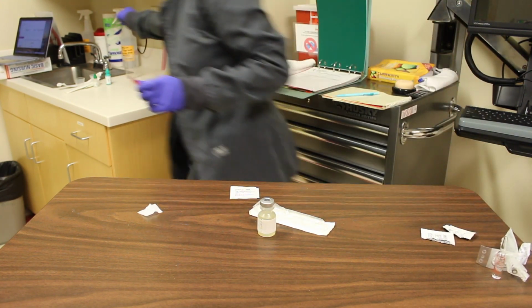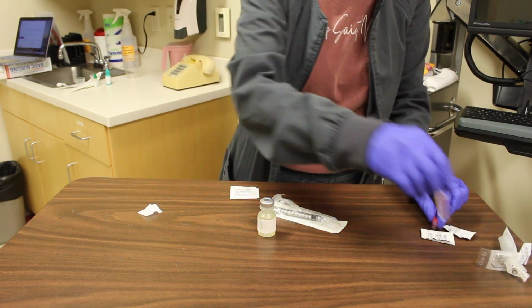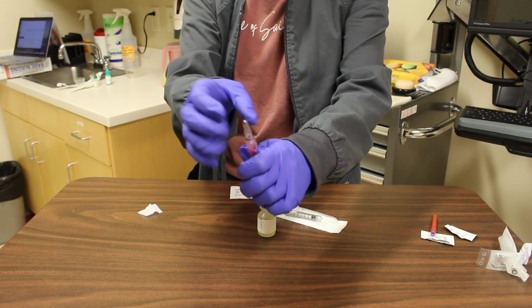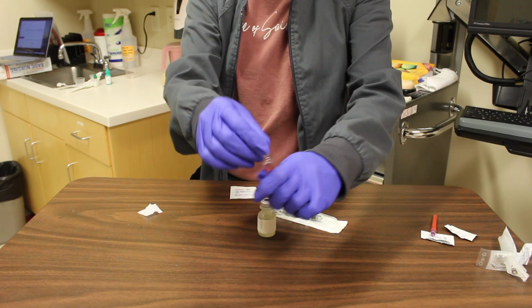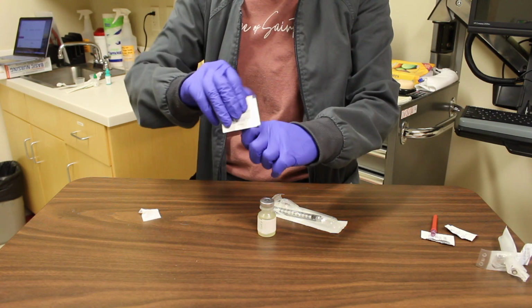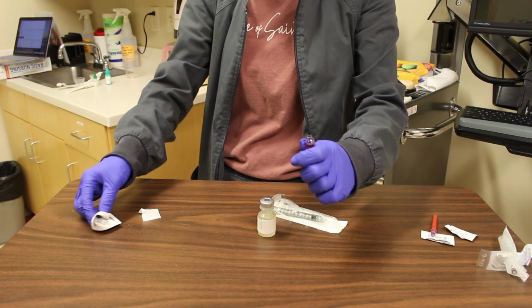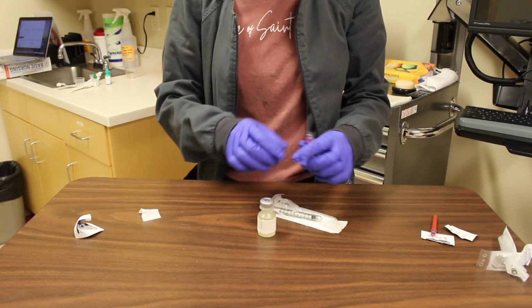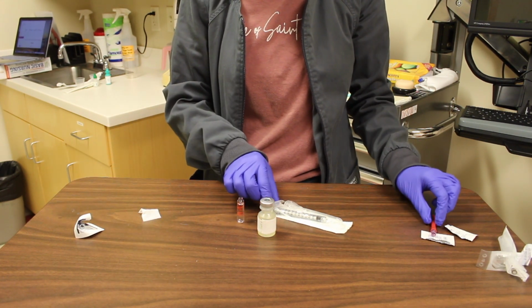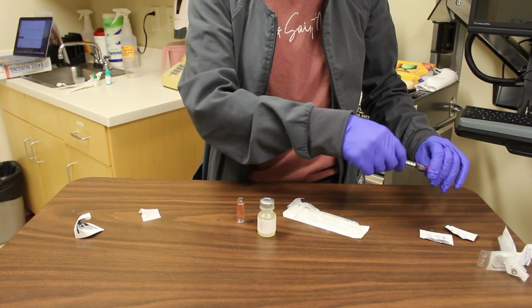Next is drawing up from ampules. Gently flick or tap the top of the ampule to make sure that all the medication that might be trapped at the top of the ampule moves to the bottom. Using an ampule snapper or 2x2-inch gauze pad, break the top of the ampule, making sure to break it away from you. Attach the filter needle to the syringe. A filter needle is needed anytime you are working with glass.